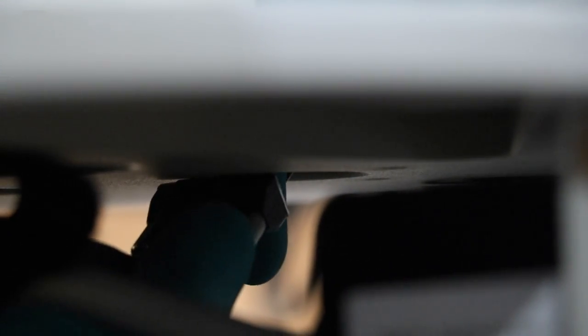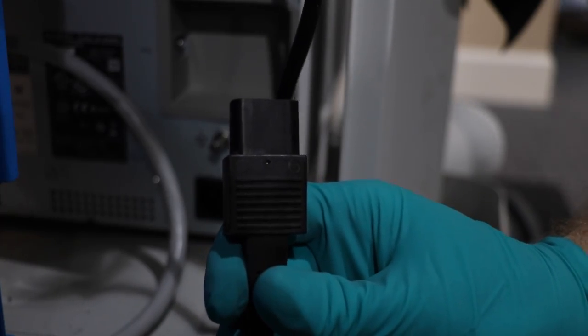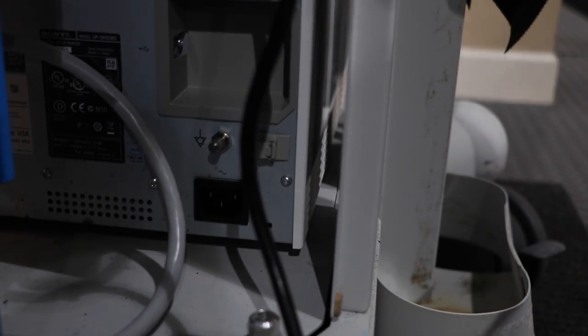We'll take our power cable and plug it into the back of the 10K. And finally, let's plug in the power for our UP-DR80MD Sony printer.